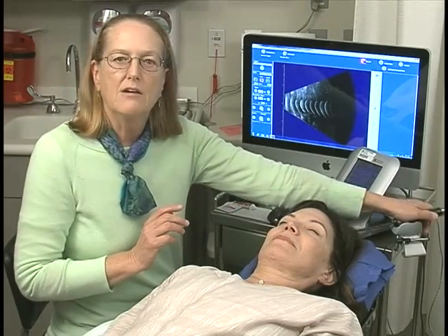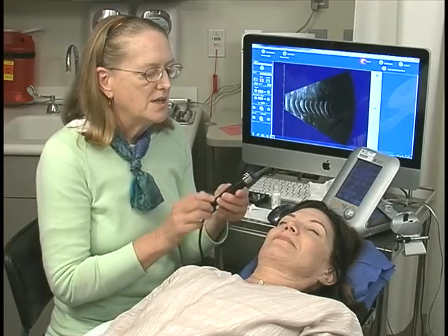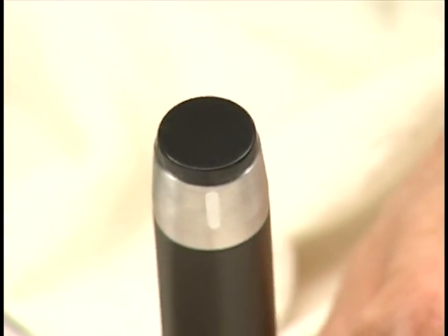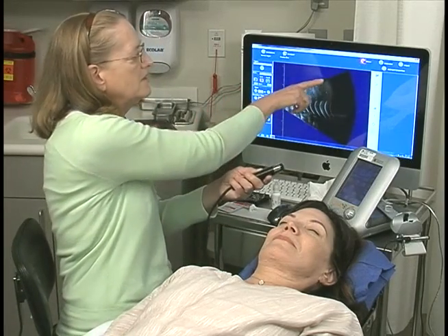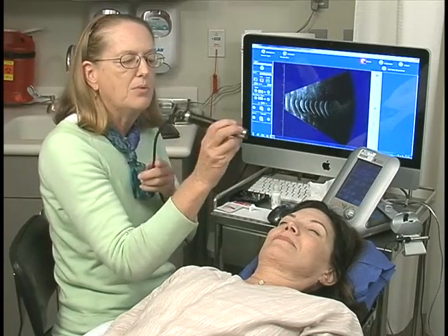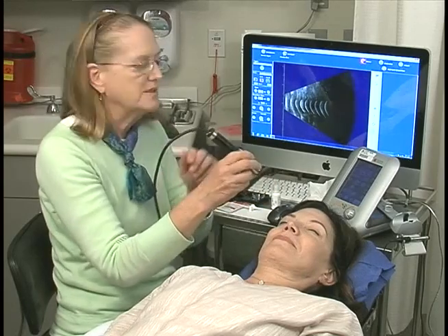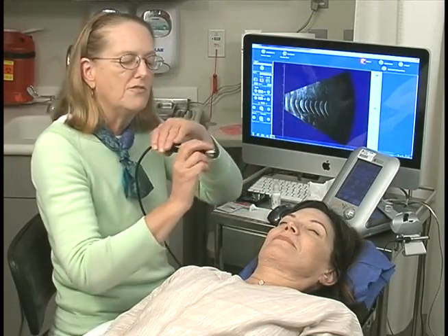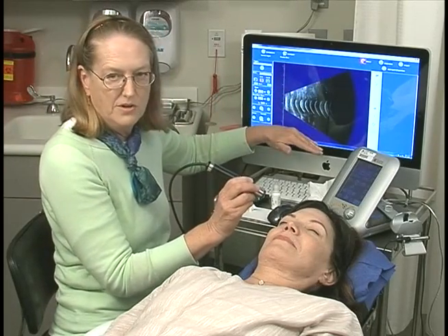In order to be clear about where in the eye we're imaging, we need to understand that the mark on the B-scan probe is a very important orientation. It tells us where on the B-scan the top of the screen is oriented. So, for example, if the probe marker were placed nasally to do a horizontal scan, we would have a nasal-temporal scan. If the marker were superior, it would be a superior-inferior scan.